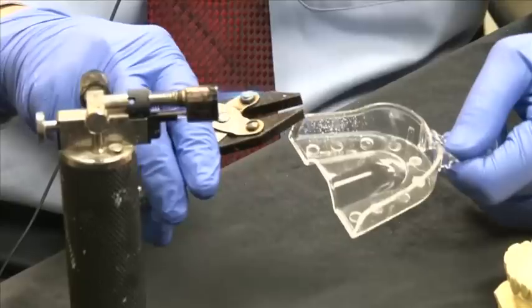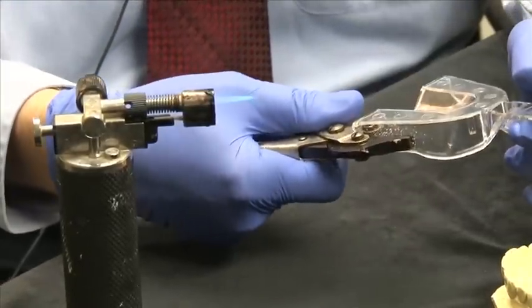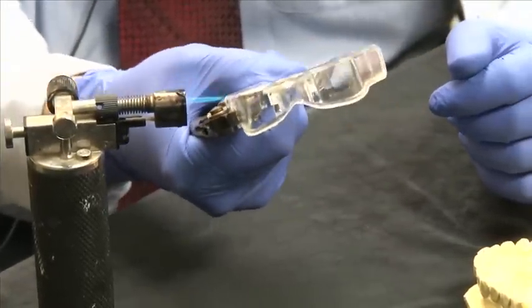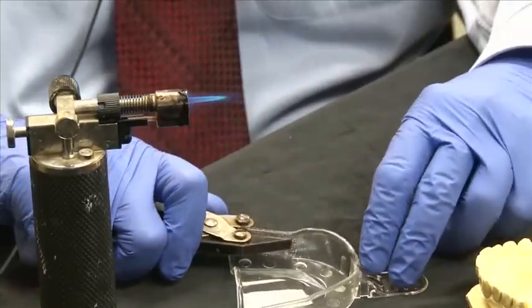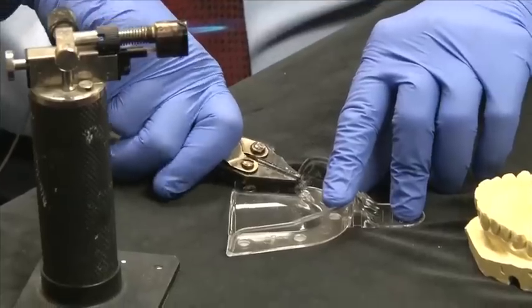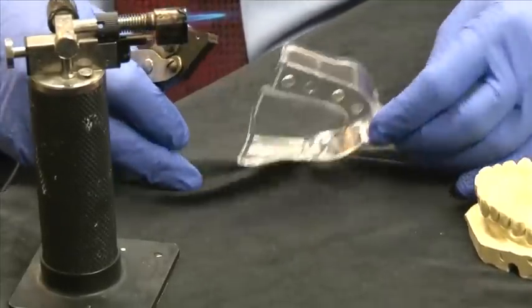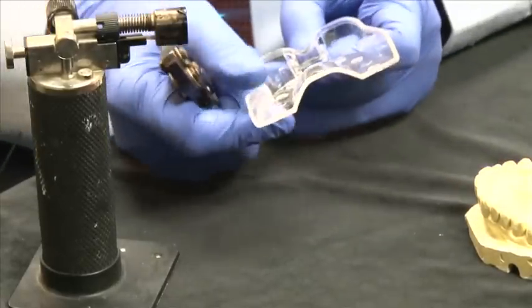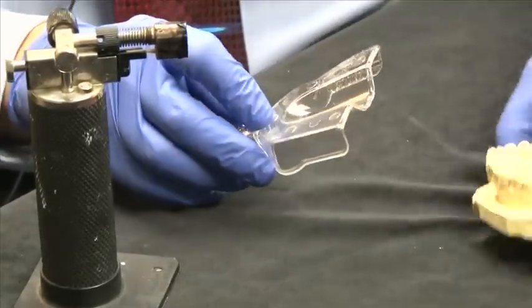Using sergeant pliers, grab it so that you're leaving some area warm, then heat it a little bit more and just push it down and out. Basically what you've done is you've literally flattened it out and widened it so that it will better fit the model.